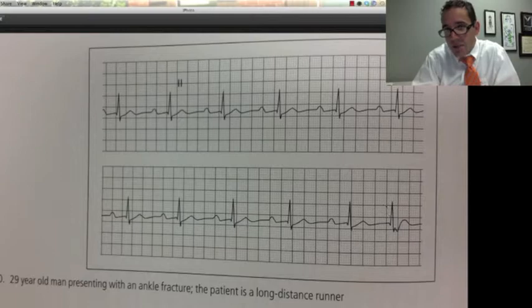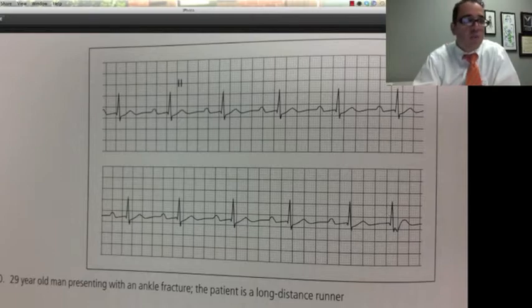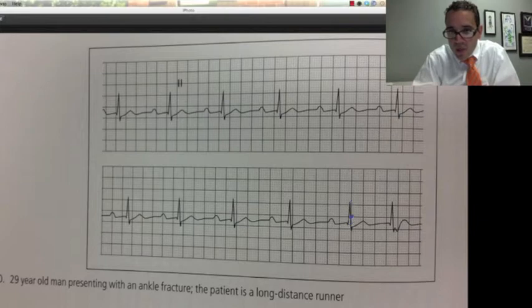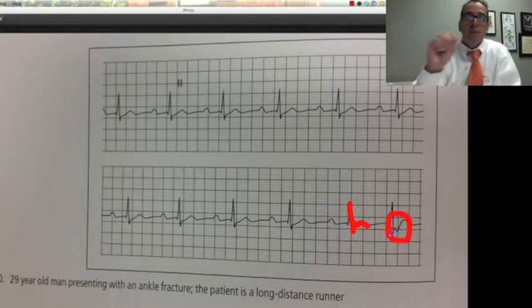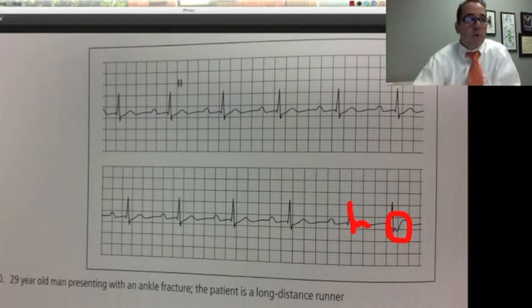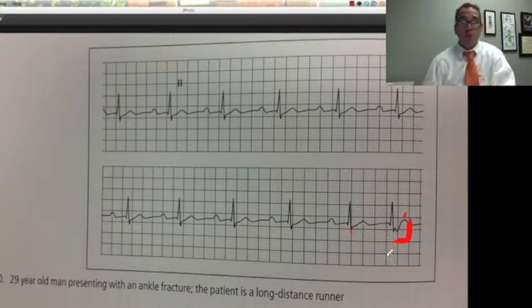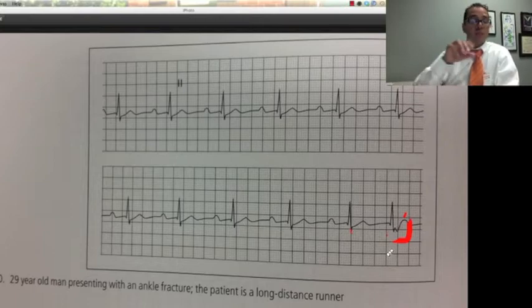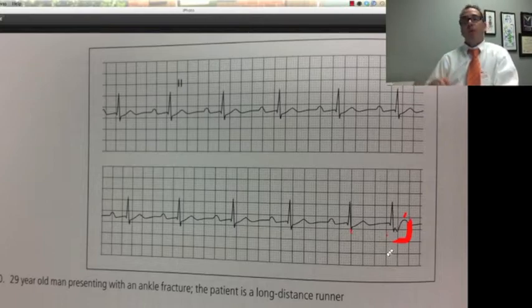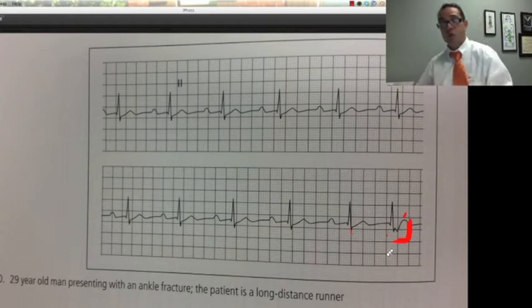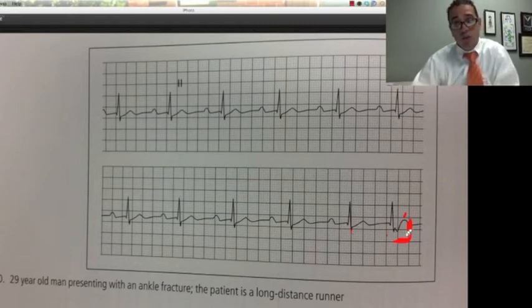The important thing is this last beat — notice how different it is. You can see the Q, R, S, and then here, but this one has an abnormal ST repolarization. That particular beat did not have a P wave, so it's a premature contraction not coming from the sinoatrial node. Is it a premature atrial? No. A premature ventricular? No. It's a premature junctional contraction.